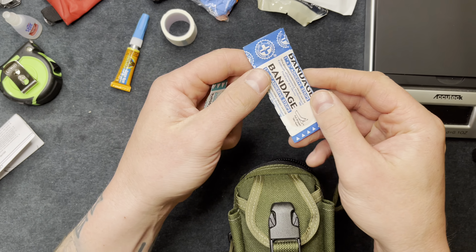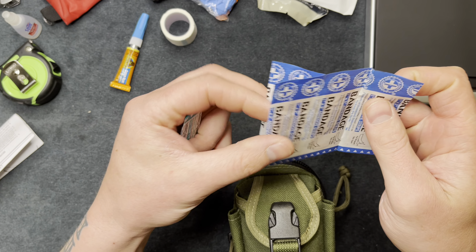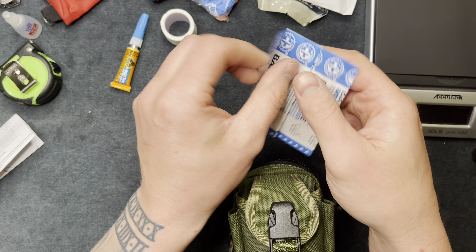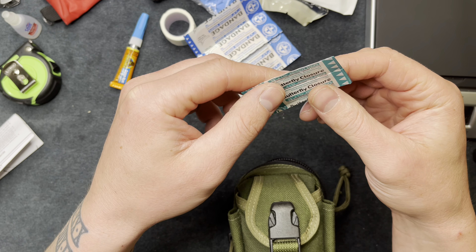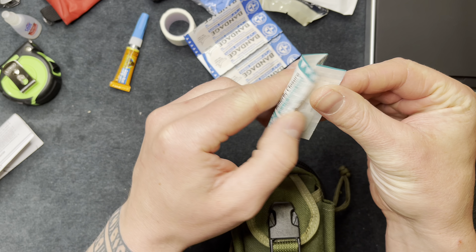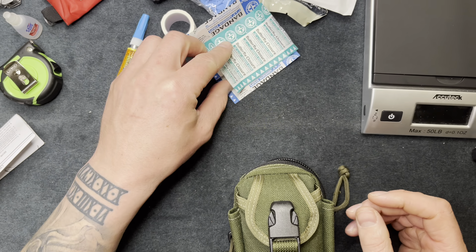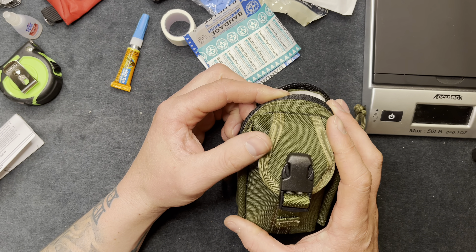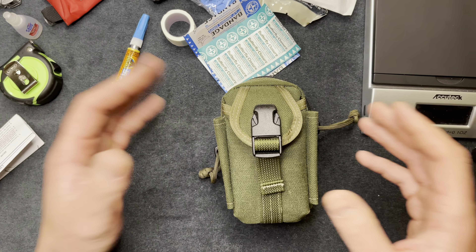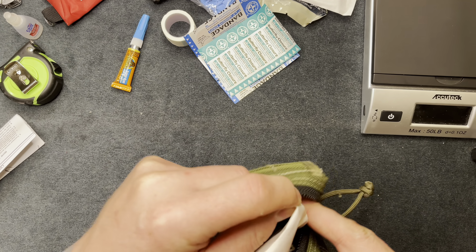I have big band-aids — probably about five or six of them. I also have some butterfly closures, about five of those. Some of these came from a kit I bought at Sam's Club — it was a big pack of bandages for about twenty-five dollars, so I pulled some of that stuff to put in here.